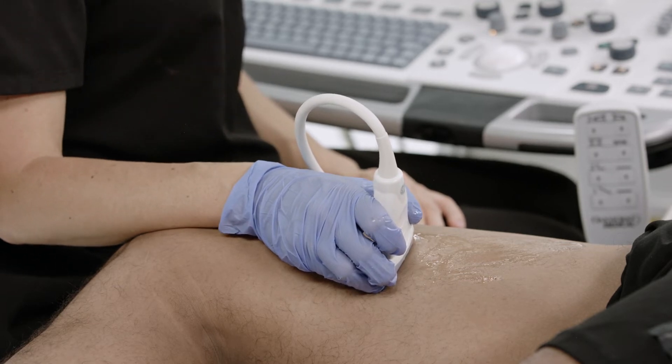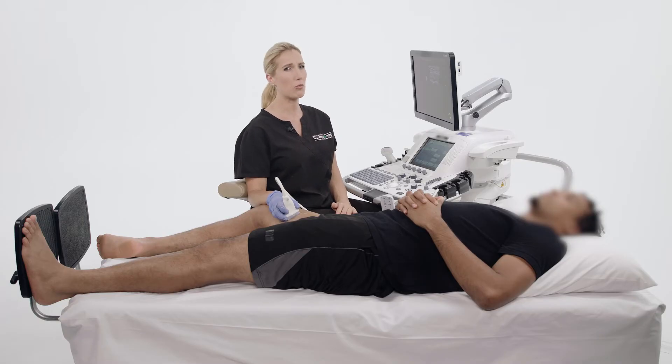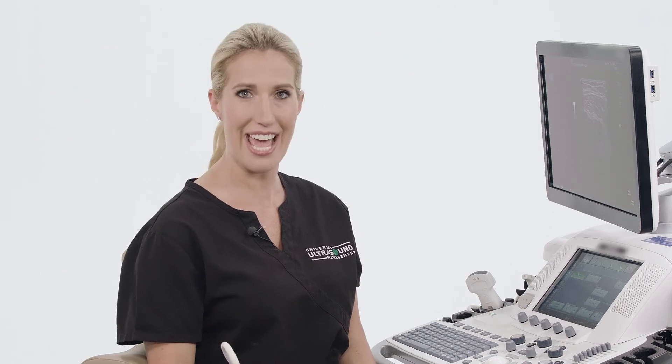If you are experiencing discomfort or pain while scanning, you are probably doing something wrong. Stop, reposition yourself, and ensure to carefully consider ergonomics prior to continuing the scan.